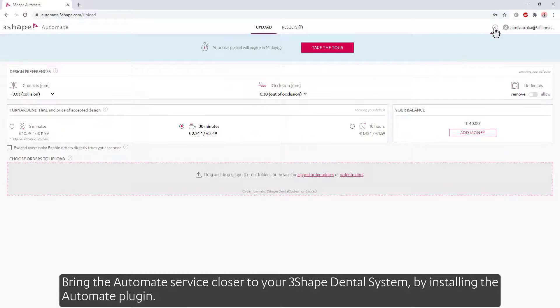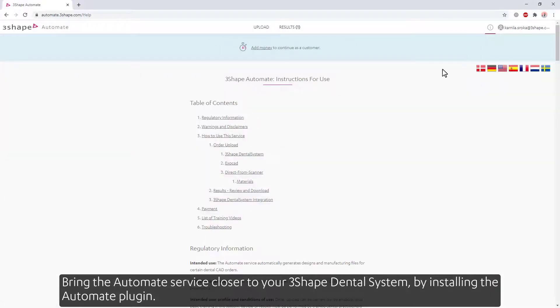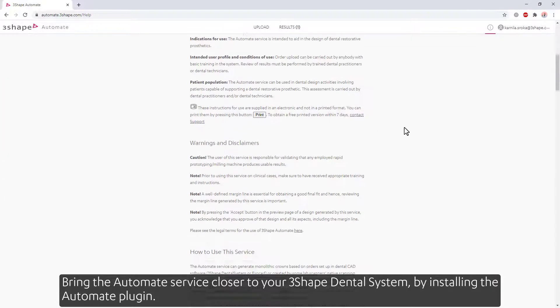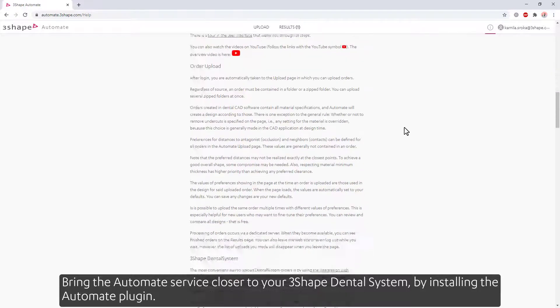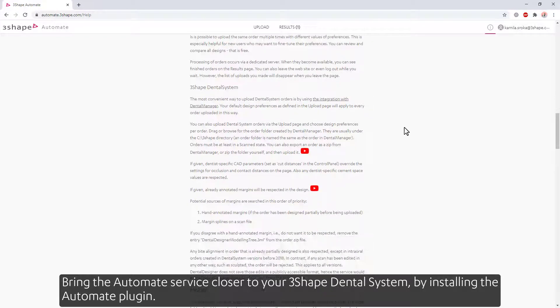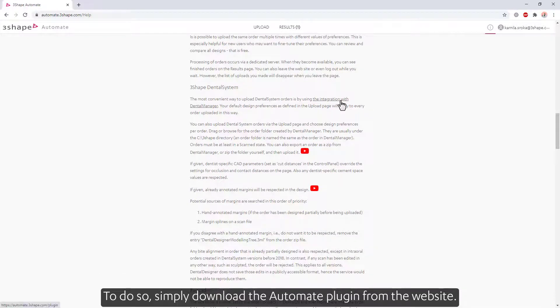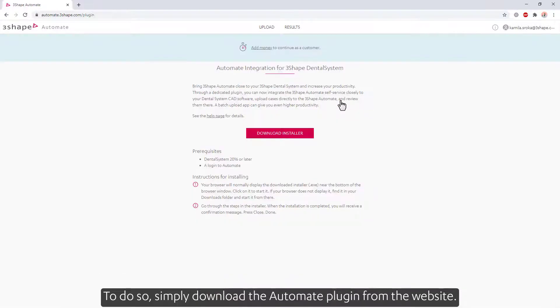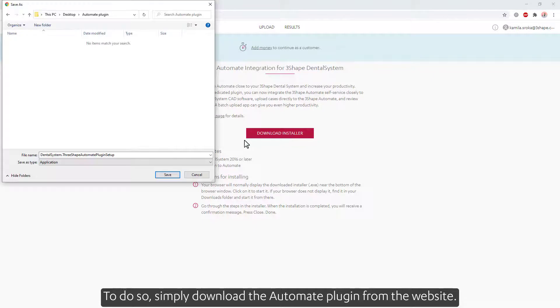Bring the Automate service closer to your 3Shape dental system by installing the Automate plug-in. To do so, simply download the Automate plug-in from the website.